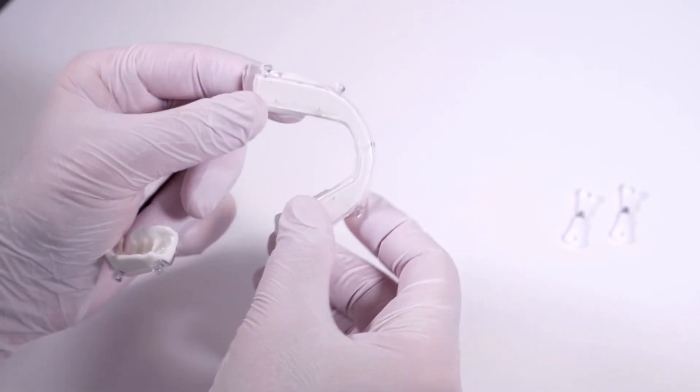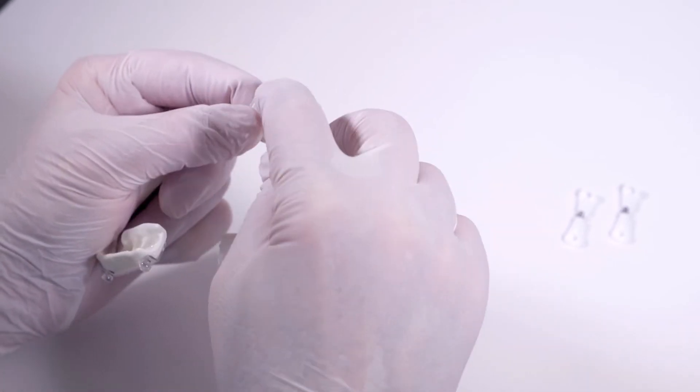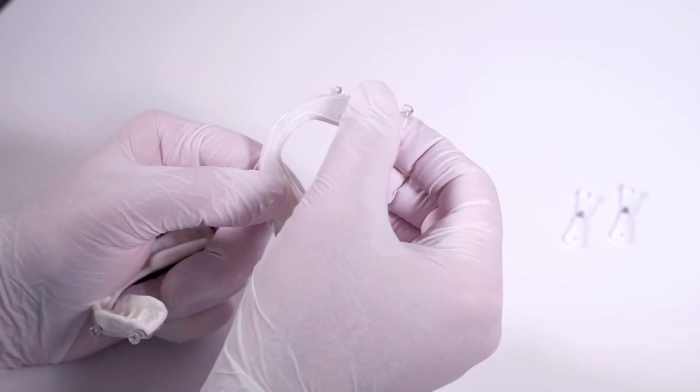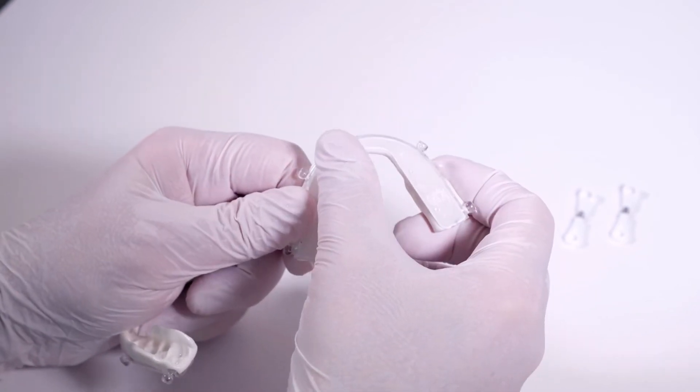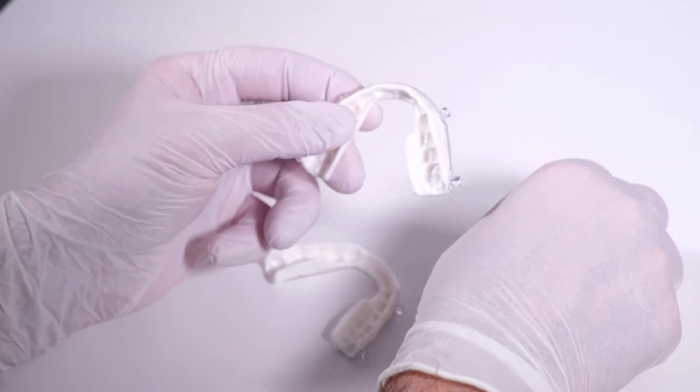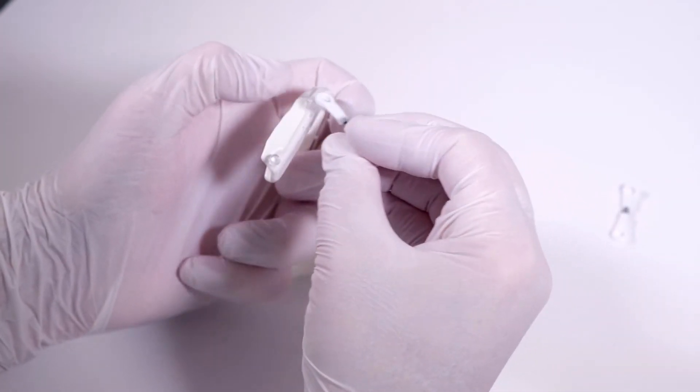After reheating, the thermoplastic material reverts almost to its original form. There should be no thermoplastic material on the hard outer tray shell and around the fixation knobs. If necessary, carefully remove it by heating the spots locally in a hot water bath.